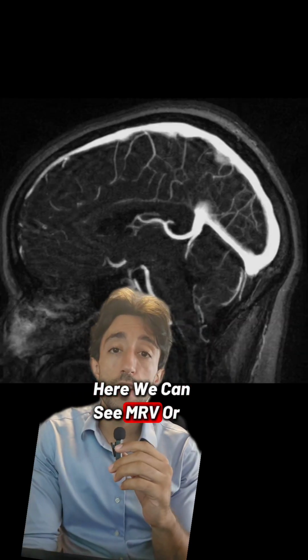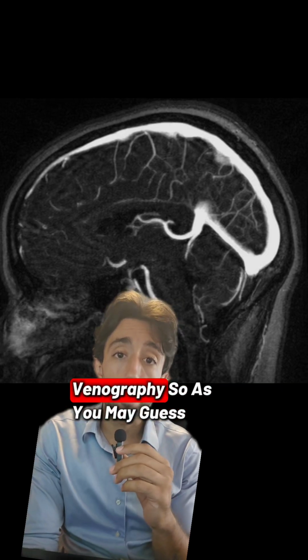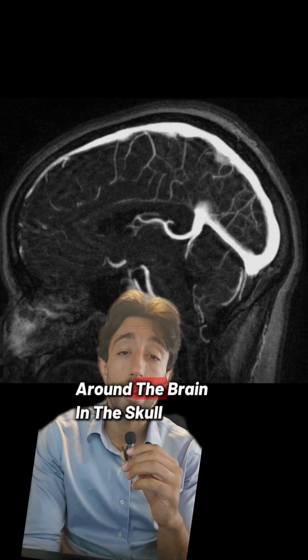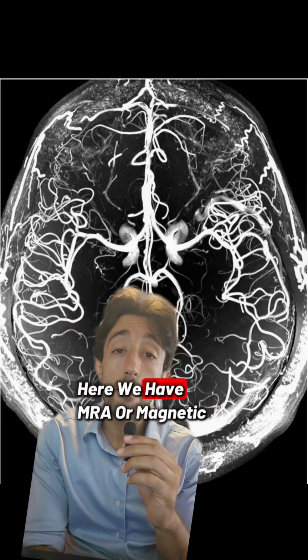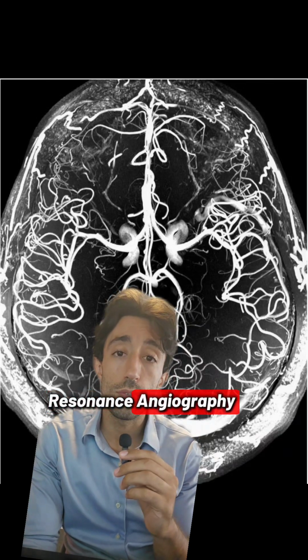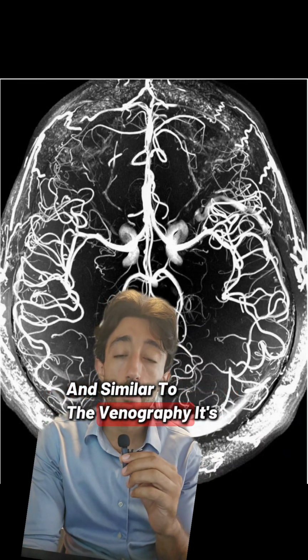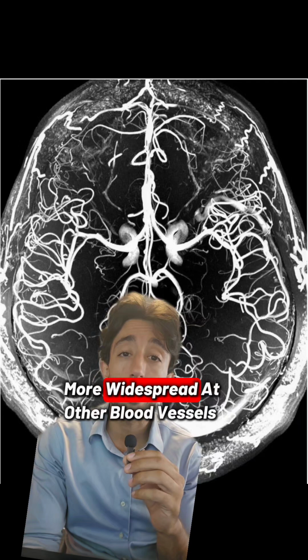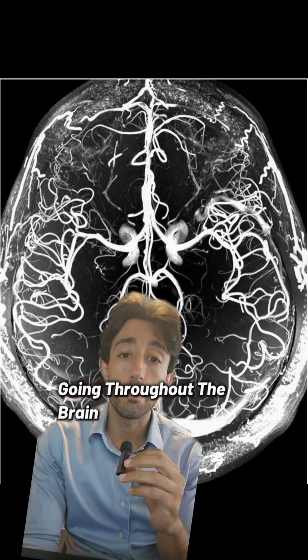Here we can see MRV, or magnetic resonance venography. So as you may guess, this is going to be looking at the veins, particularly the ones that are going around the brain in the skull. Here we have MRA, or magnetic resonance angiography, and similar to the venography, it's going to be looking at the blood vessels, but instead of just looking at the veins, this is going to be looking more widespread at other blood vessels going throughout the brain.